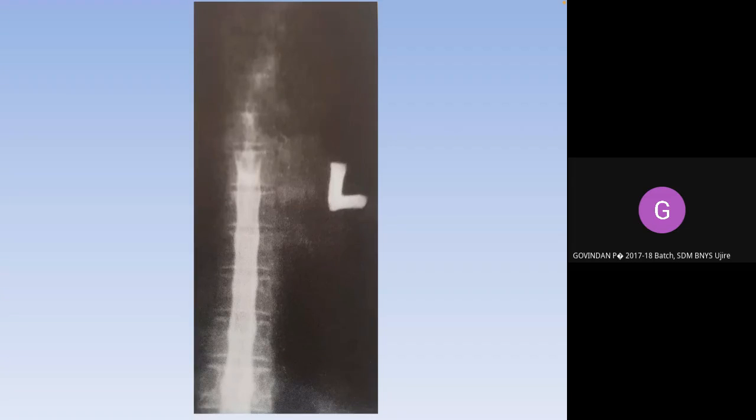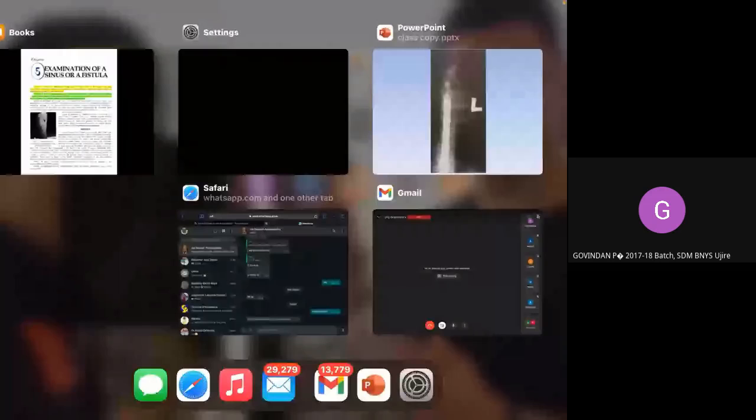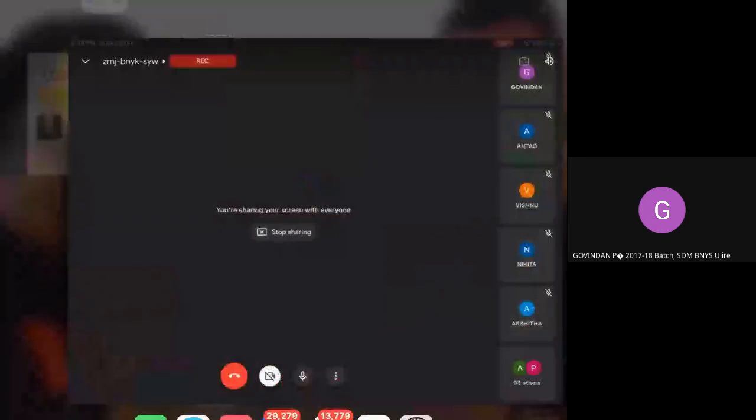Abnormal, sir. Yeah, definitely abnormal. What has happened is the spinal column is okay till here, but above this the contrast is not gone. That means there is some stenosis of the spinal canal or some pathology which is lying there. Hence, the contrast has not gone up.